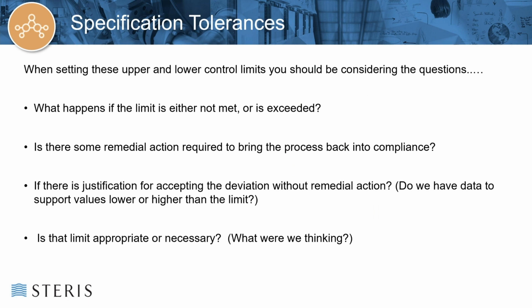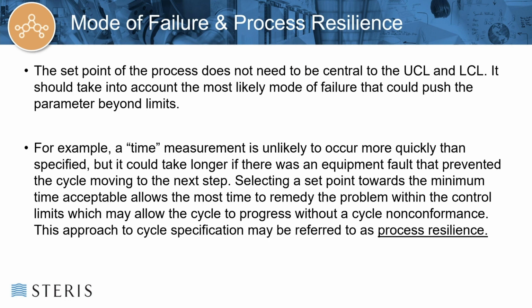That's going to be the set point for our cycle. Then based on our data, we see that we still have kill and the appropriate spore log reduction in SAL if our full cycle runs at least 340 minutes. So that's 20 minutes shy of the set point.